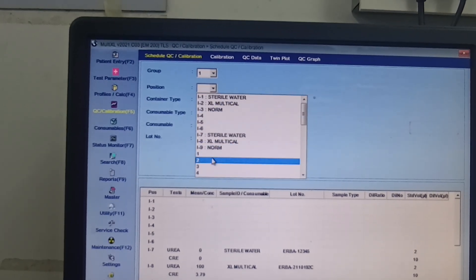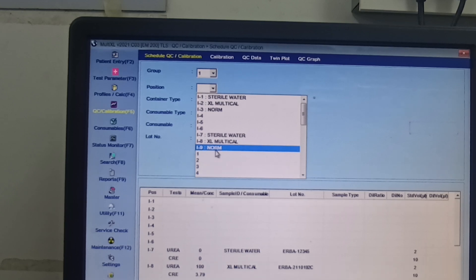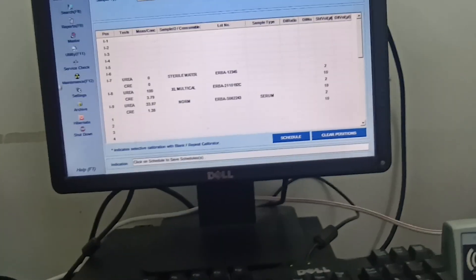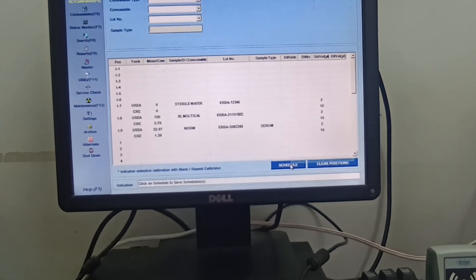After that, similarly click Norms. During the calibration you must also run the control, because without the control you can't measure the calibration value or confirm whether calibration is successful or not. Similarly, select urea and creatinine, press OK. The programming for calibration is now ready — click the Schedule button.